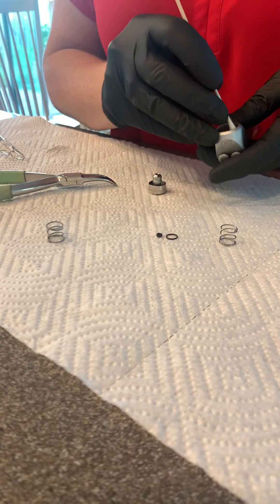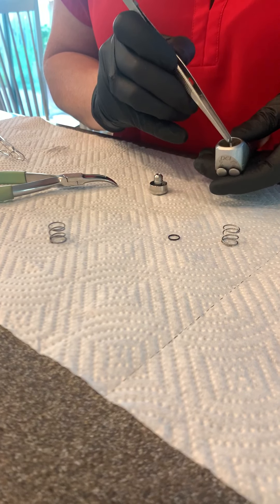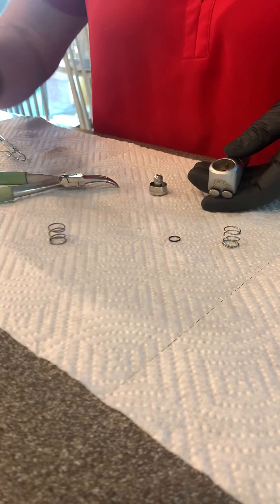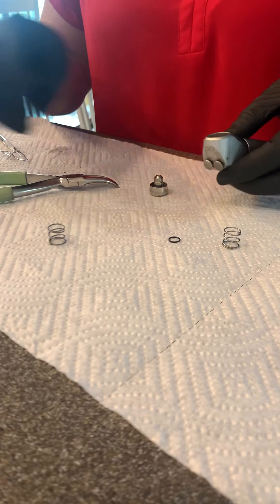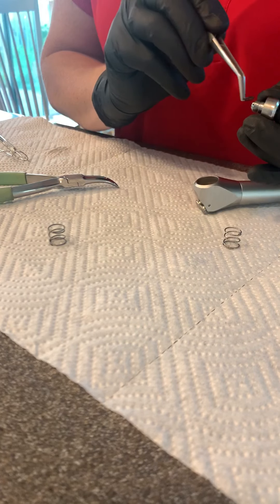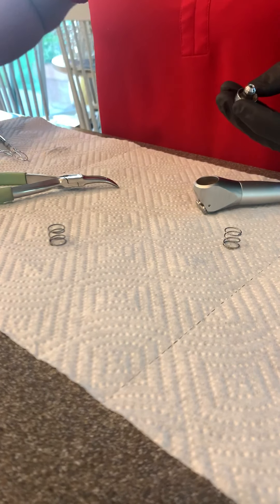Go ahead and clean that out. You can replace the O-ring — it goes all the way at the bottom. You can't miss it; it's the only space it can go and it goes flush in there. I usually will use the end of this to kind of push it into place. Go ahead and replace your second O-ring — it goes onto the bottom of those threads, the very last notch there.